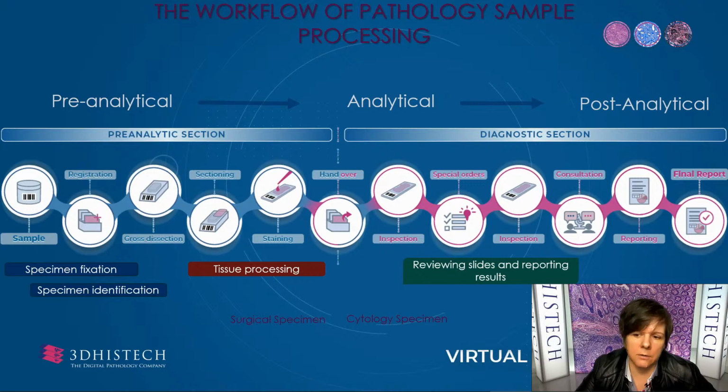The primary role of the histology laboratory is the provision of a diagnostic service through the preparation, analysis, investigation and interpretation of tissue samples. Given that the procedures involved are so complex, it is unavoidable that errors can transpire throughout the stages of the entire process.